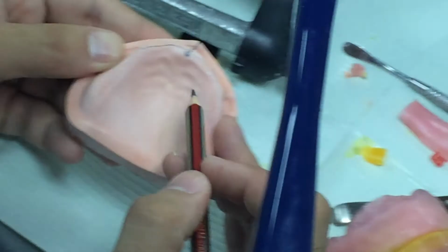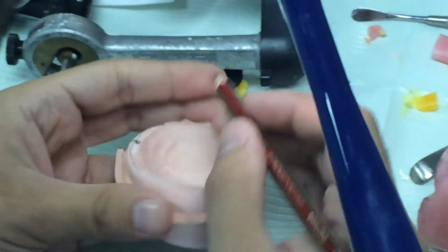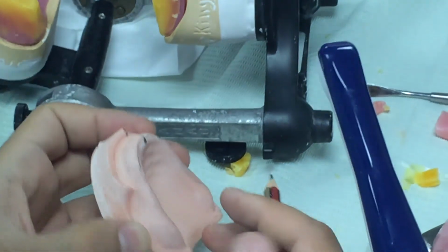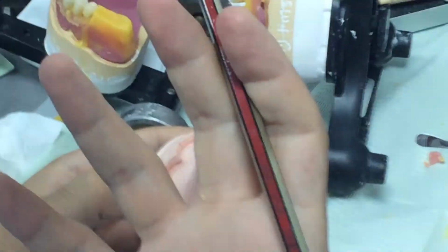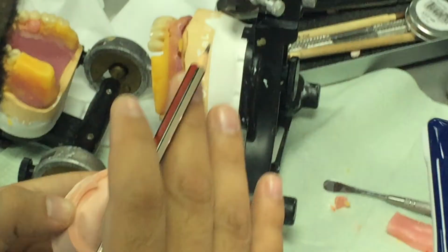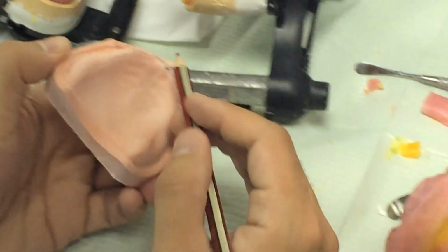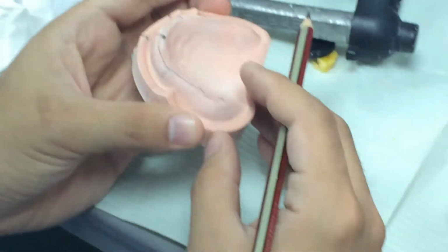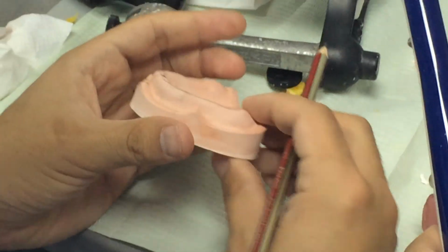You see how I draw this one? The crest of the ridge, then there is an angle here going out. Angle here. All I have done is draw the crest of the ridge, to show you the shape of the jaw. Even without guidelines, it works, but for you guys you have to draw the guidelines.